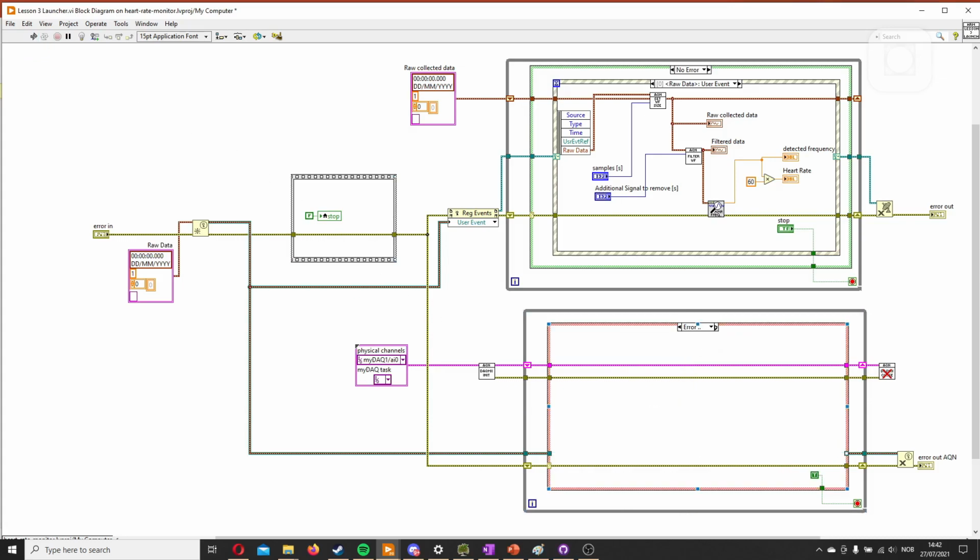So we have a few errors left, as we can see with the broken play button. And this is probably just the wiring here. And now this should do the exact same thing as what we started with, but it will do it in parallel without anything interfering with the acquisition. This will make more sense when we make the larger application, when we add more and more here, things that would hold up the application, stopping this one from reading. So let's test it now.